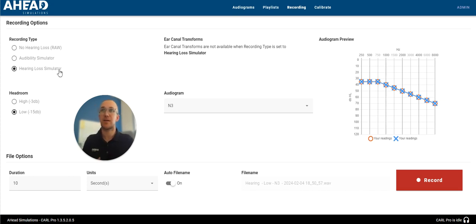Now, when we used the hearing loss simulator, this made the child's hearing sound very, very scary, and we were nervous that it would actually have an adverse effect and it would deteriorate the willingness for the parent to really take action, and it would be so scary that it wouldn't be helpful.